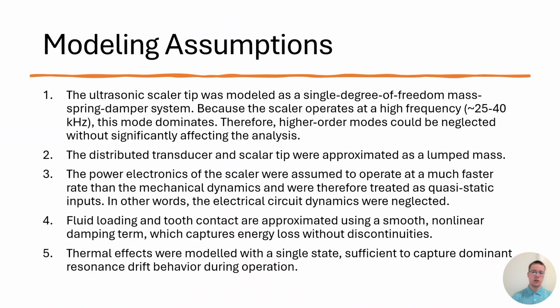The modeling assumptions were relatively simple. The first one was that the scalar tip was modeled as a single degree of freedom mass spring damper system, to ease up calculations. The second was that the scalar tip and transducer were approximated as a single lumped mass. The third was that the electric circuit dynamics were neglected. Fourth, fluid loading and tooth contact, which can be unpredictable, were approximated using a smooth nonlinear damping term. And finally, the thermal effects were modeled as a single state, sufficient to capture dominant resonant drift behavior during operation.